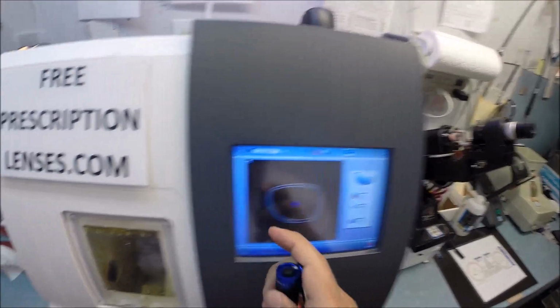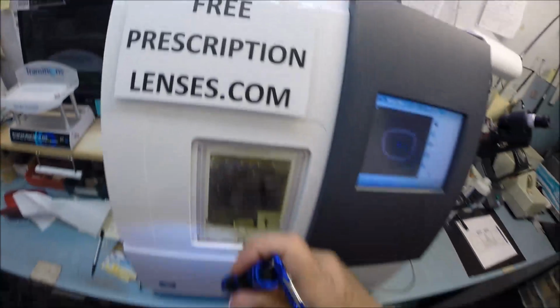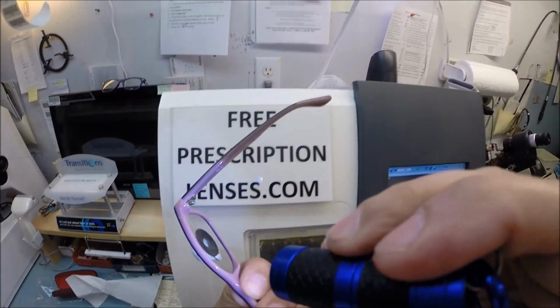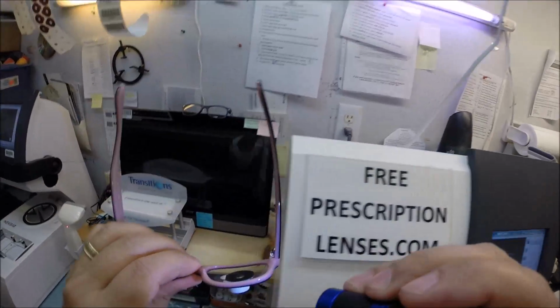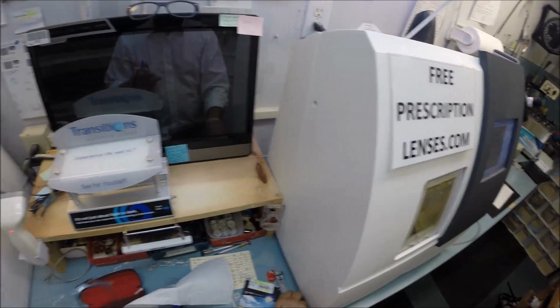So that is the shape of the left lens. It is measuring the thickness of the lens at every point to know exactly and precisely where to place the bevel, so you have the least amount of edge thickness, of which you got none. You ain't got nothing. No edge thickness, because you got the thinner lenses and this plastic frame that hides it all.